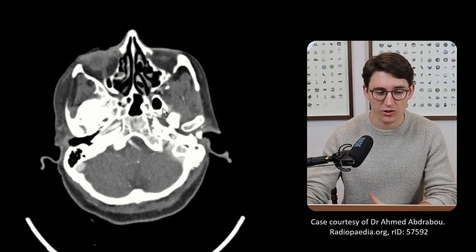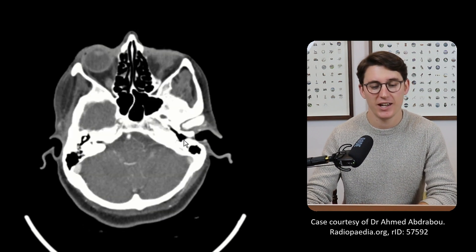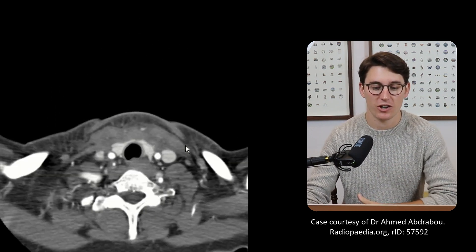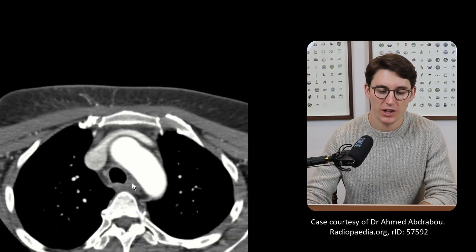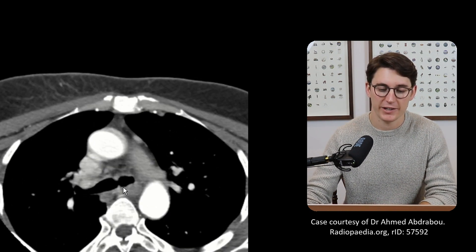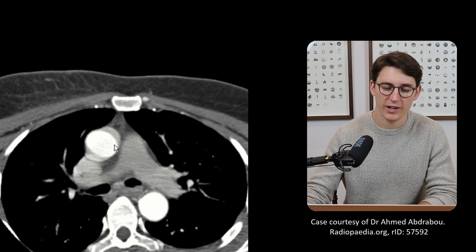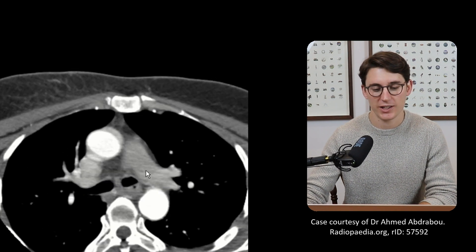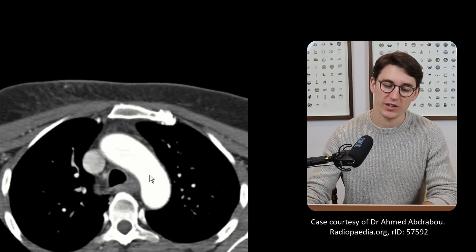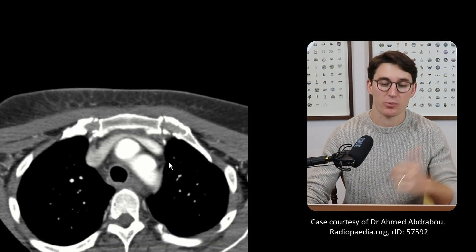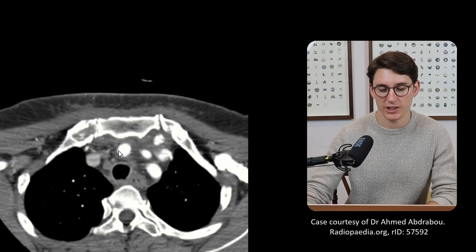So here we have an axial contrasted arterial phase CT. I want to scroll right down in the chest — we're going to start at the heart and work our way all the way up. We follow the trachea down; it should bifurcate here at the carina. Here we can see our pulmonary trunk, our ascending aorta, and our descending aorta. As we work our way up, we'll see the arch of the aorta starting to form. Now we know that there are three branches that come off the aorta.